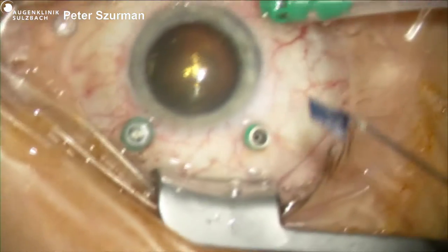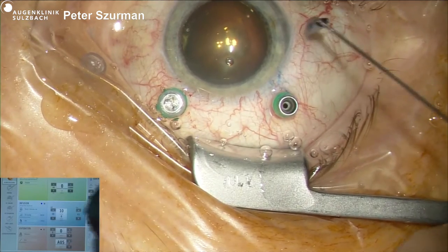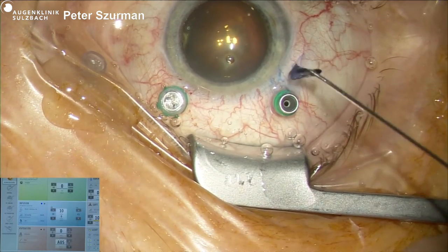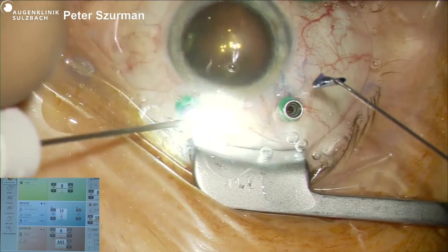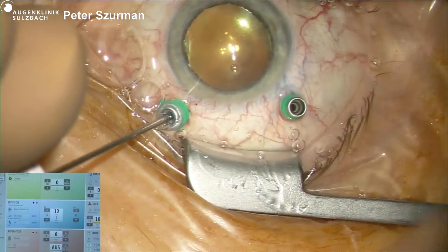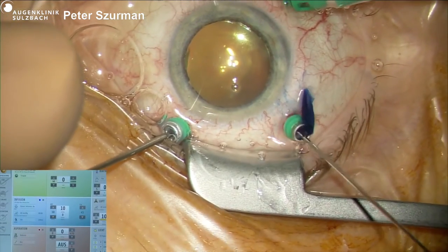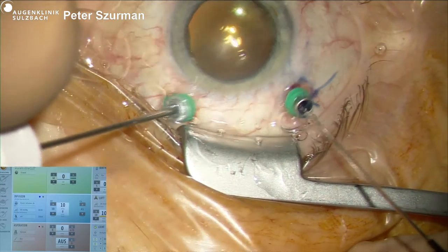Yeah, correct. And the new Avitar trocars, which are funnel-shaped, help to introduce it. Yeah. That's it.